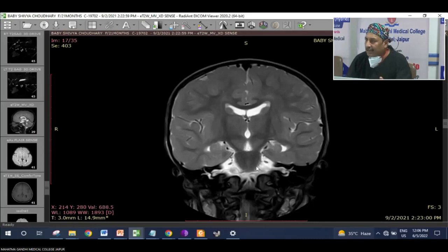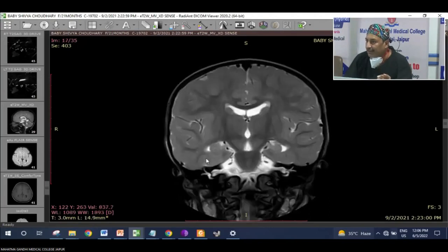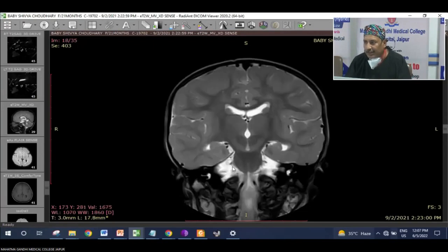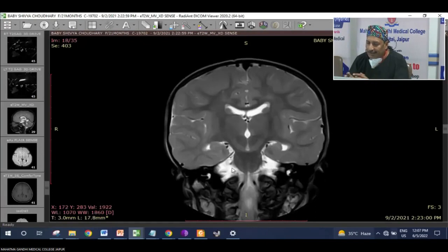If the implant is not possible for the patient, affording so many things, you can at least stent the cochlea with a dummy implant to keep the lumen intact for the future. So the MRI sequences are very important. Timing of MRI is very important. What sequences can give you the best information, the earliest changes, are most important, and that you can pick up in that scenario by a 3D FIESTA. So your point is valid. A 3 Tesla MRI is more informative.